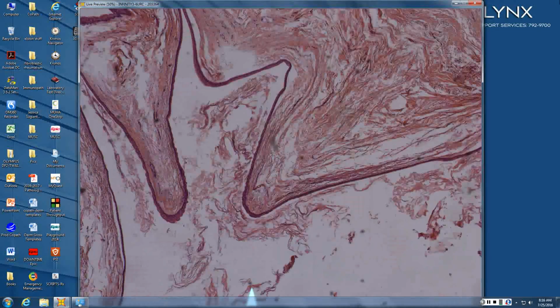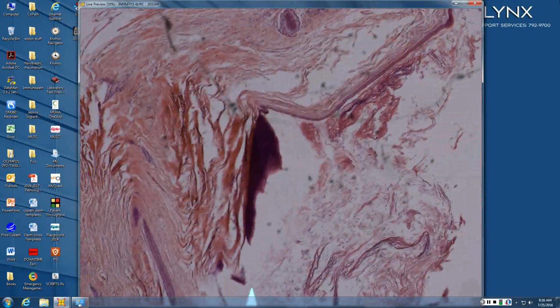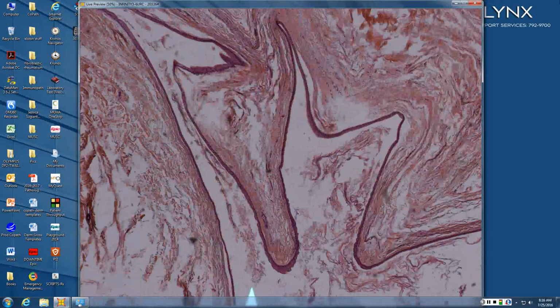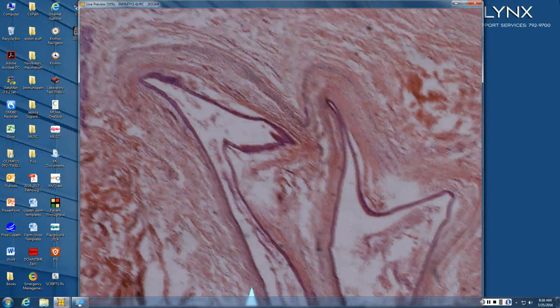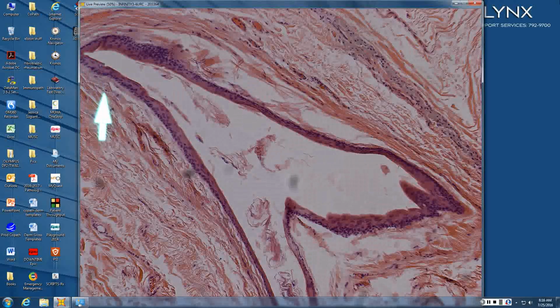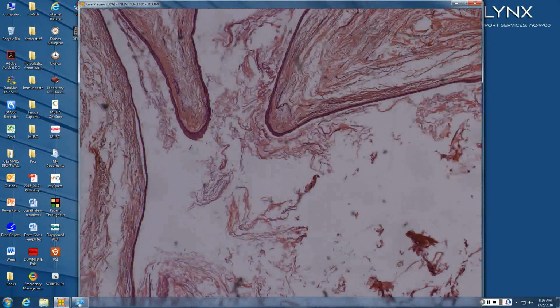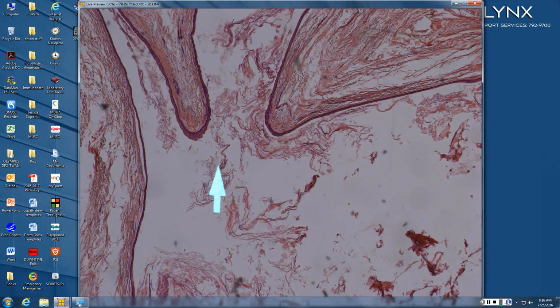This just looks like an epidermoid cyst. Do epidermoid cysts usually have that kind of outline? No. And focally, I see a little bit of a shark tooth cuticle, but it's filled with lamellar keratin rather than the oil of a steatocystoma. So how do you get a shark tooth cuticle like a steatocystoma? Dermoid. You have said it about 5 times now, and I keep ignoring you.